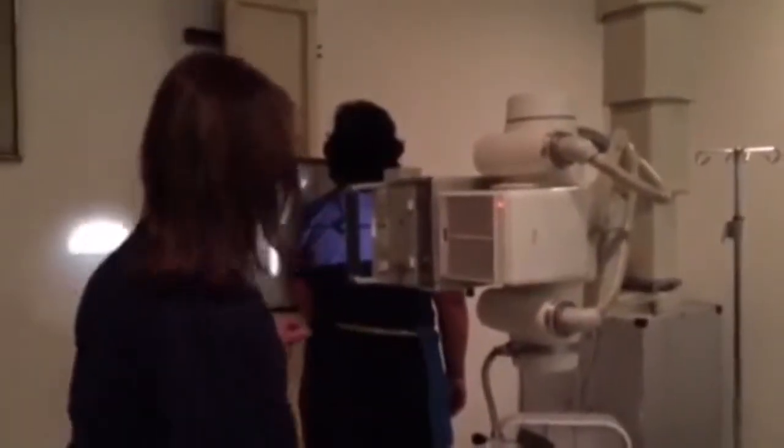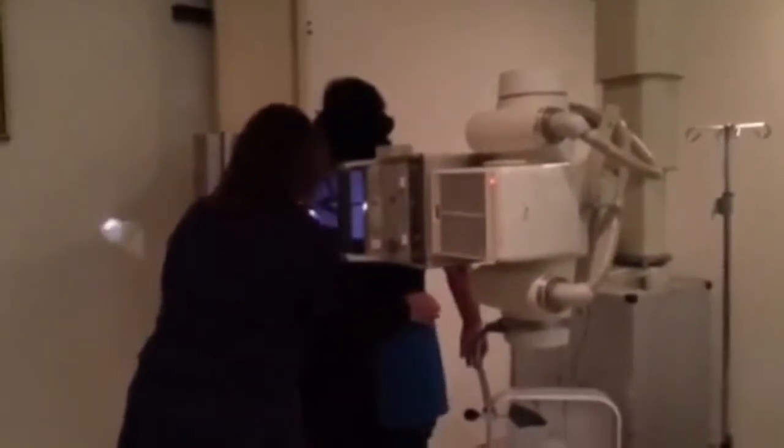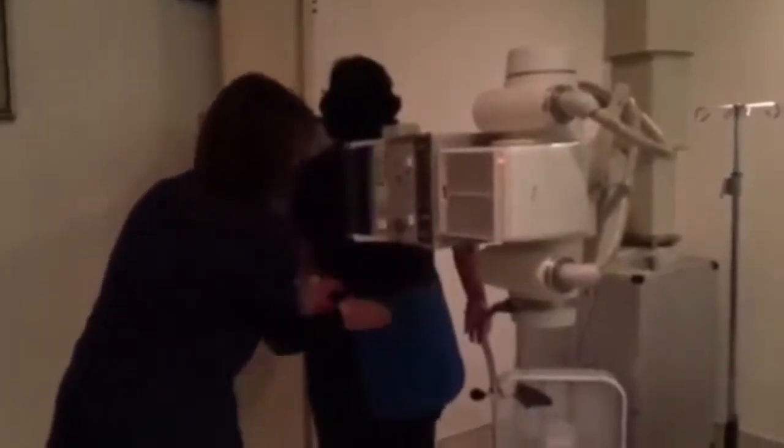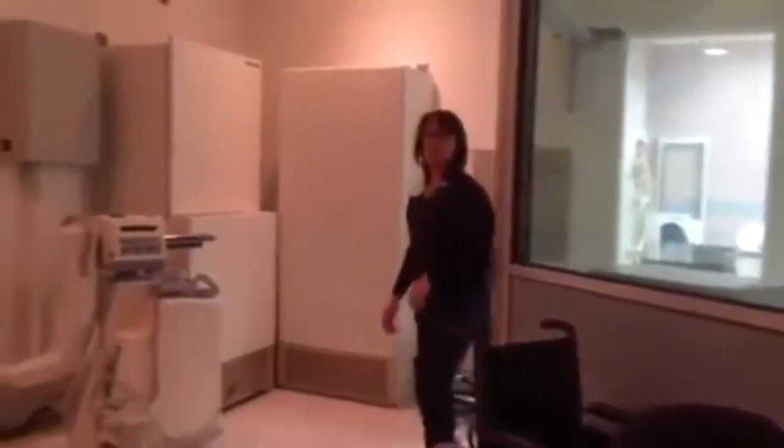Okay, hold still, Mrs. DeWitt. Adjust the shielding. There we go. Okay, real still. Okay, 70 and 13 mAs. Hold your breath for me. X-ray. Okay, you can relax.